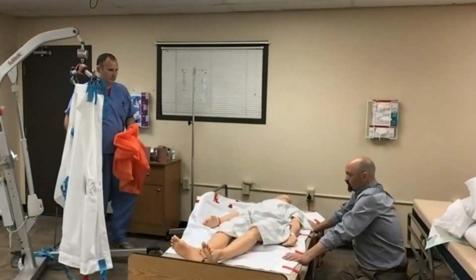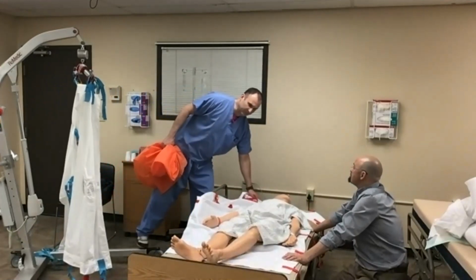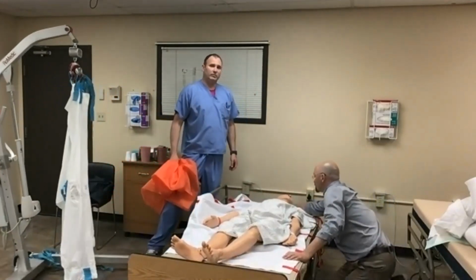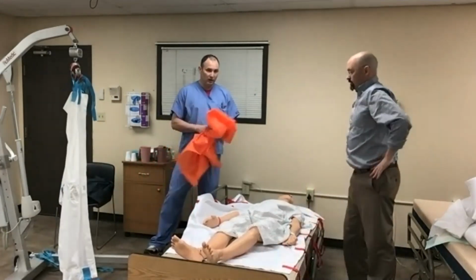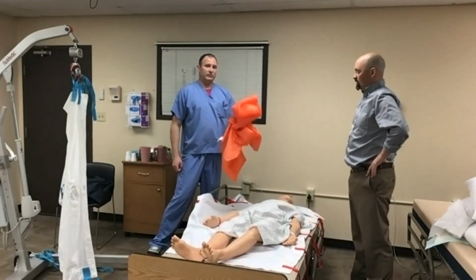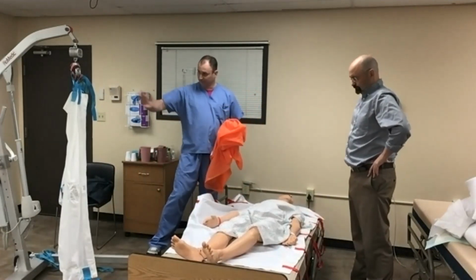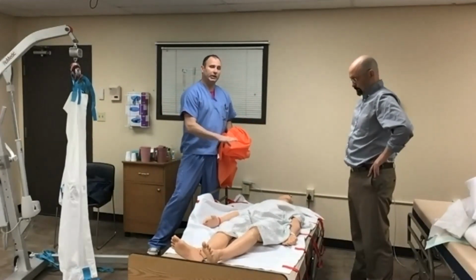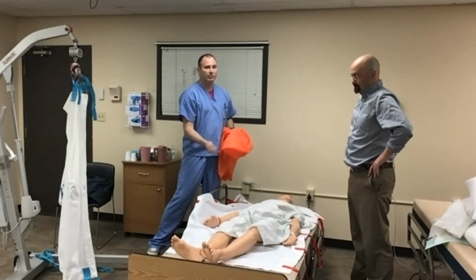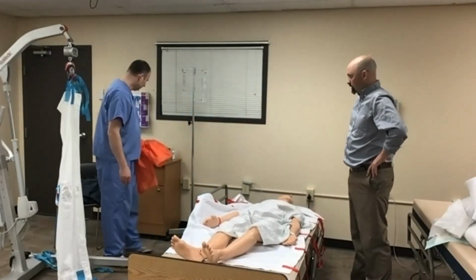Check for your tubing and everything else throughout the process. It's certainly a little tedious, but it is very safe as far as the amount of effort you have to exert. This makes it a lot easier to get the patient in the right position. Without the combination of this and the slide sheet, there's a lot more tugging and pulling of pillows and of the patient to get them in the position that you want. There's a lot of shearing that can go on for sure.